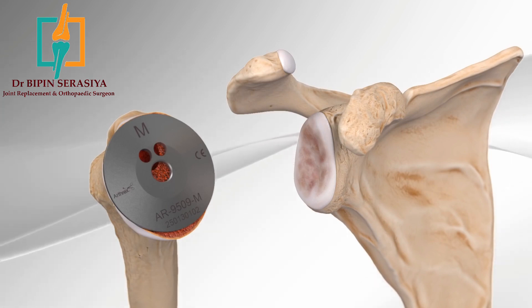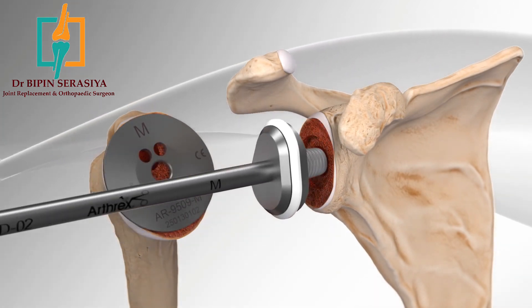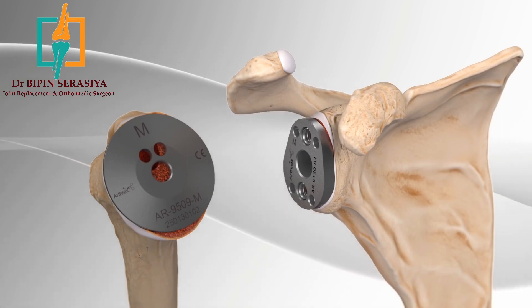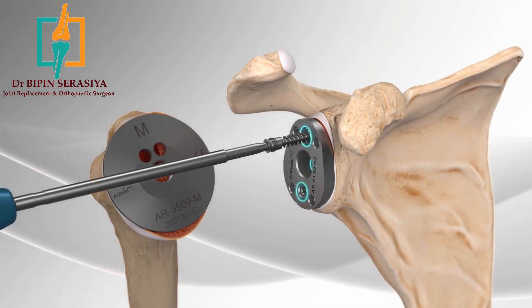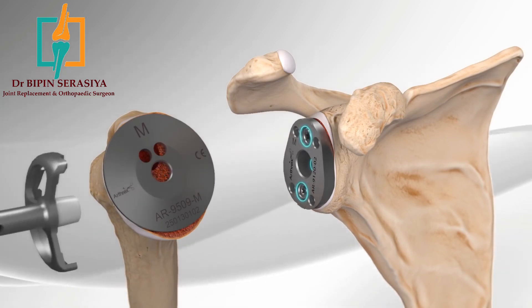Attention is then placed on preparing the socket. A series of instruments is used to mold the socket into the shape of the implant that will be secured to the bone. The size of this implant is based on the patient's anatomy. A flat metal plate is secured to the socket with three screws. Remaining bone and soft tissue from around the plate is removed.